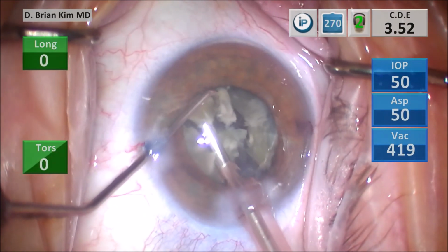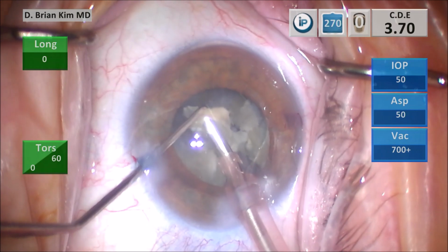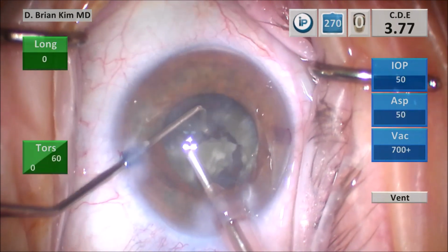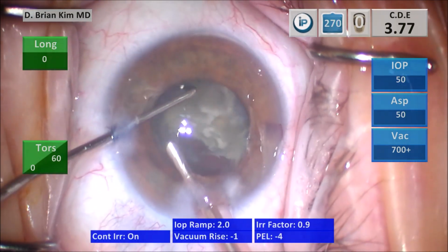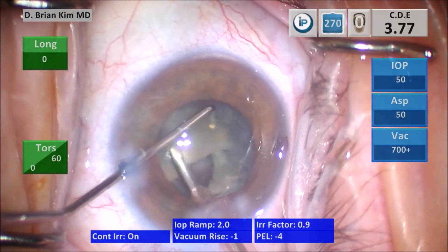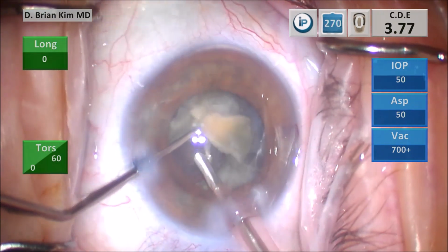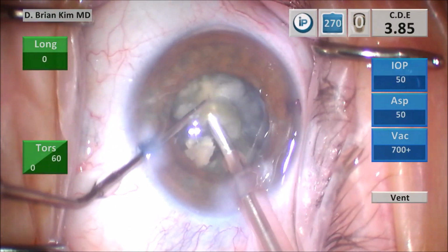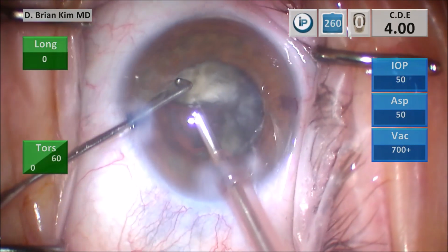So you can see this is a very systematic approach to lens disassembly, breaking up each piece little by little, using mechanical fracturing forces, essentially using the chopper and the fingertip both as chopping instruments. That's why it's called double chop, to crush the lens pieces into smaller and smaller pieces. By utilizing mechanical fracturing forces, you're not having to rely on high vacuum or ultrasonic energy to disassemble the lens.